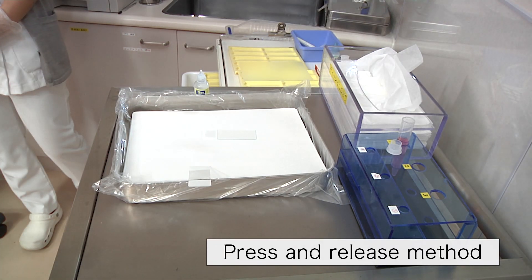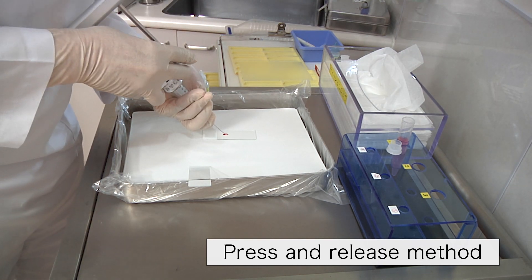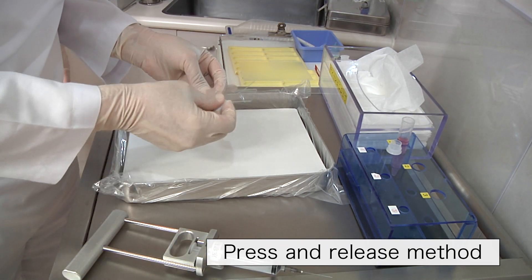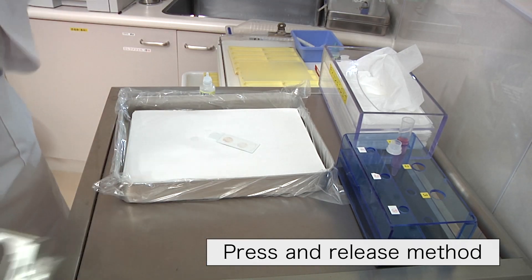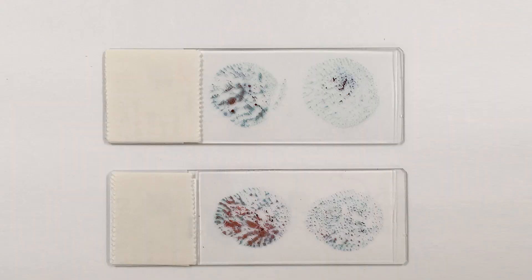Generally, we press the samples twice using another glass slide. After that, we fix the samples by dripping a fixative. You can see preparations obtained from the press and release method. The smears resulting from the first pressing tend to be thick, which is suitable to observe the cellular arrangement. The samples smeared by the second pressing are thinner and suitable to observe the cell morphology.